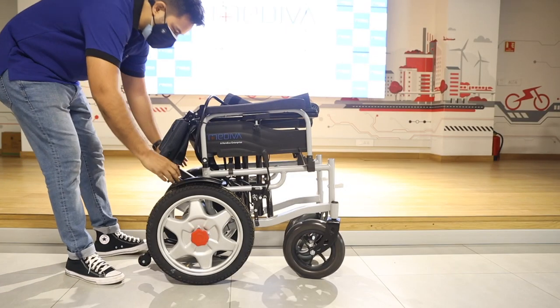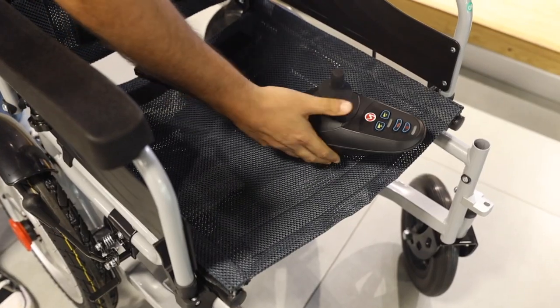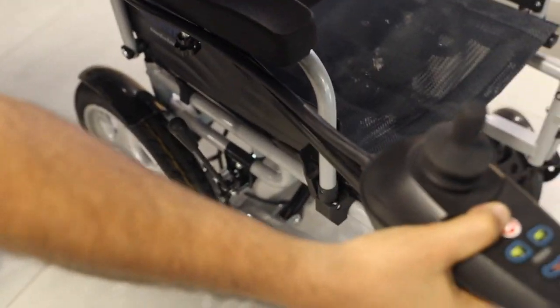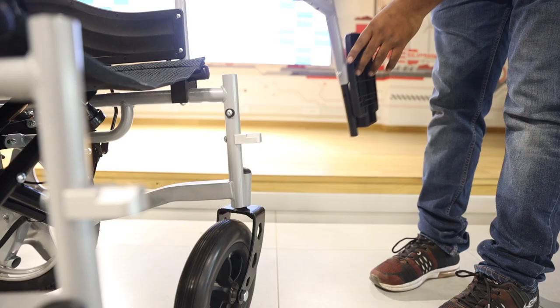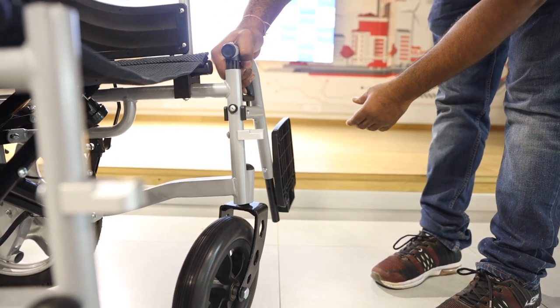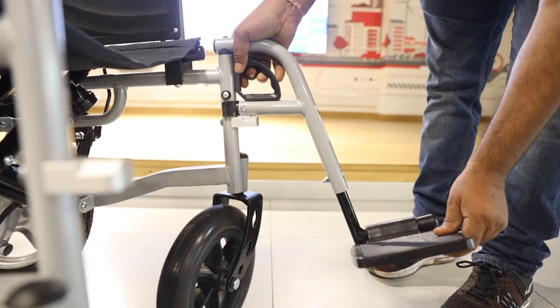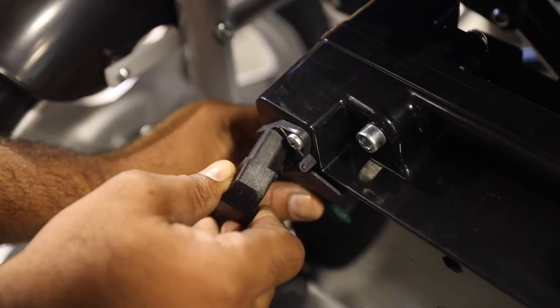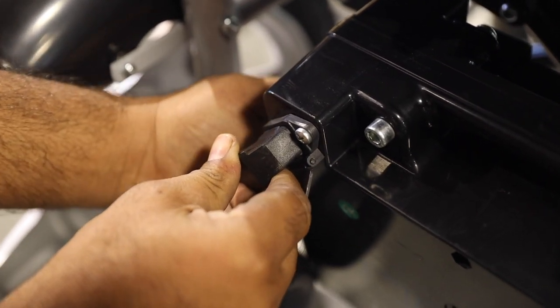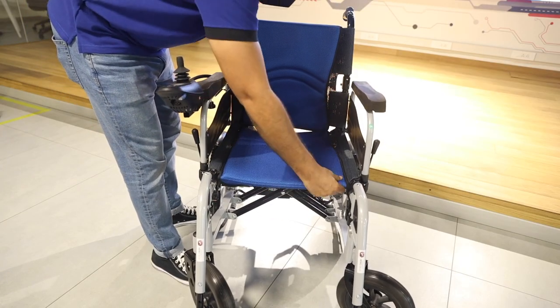To get your Mediva Electric Wheelchair started, unfold it first. Connect the joystick. Fix the footrest. Now plug in the battery. Attach the backrest, the seat and the calf strap.